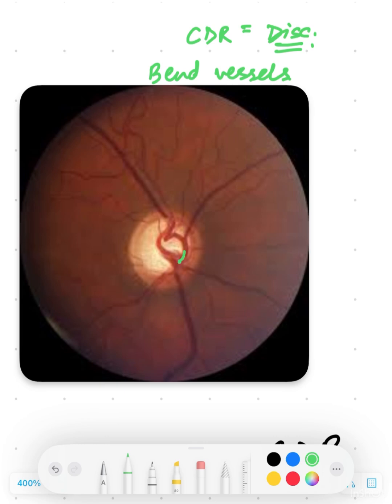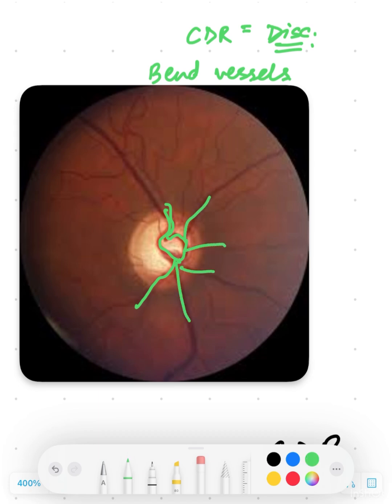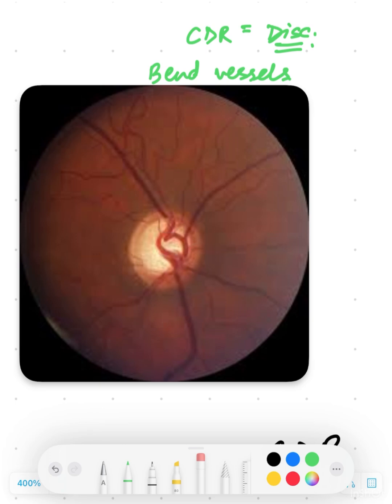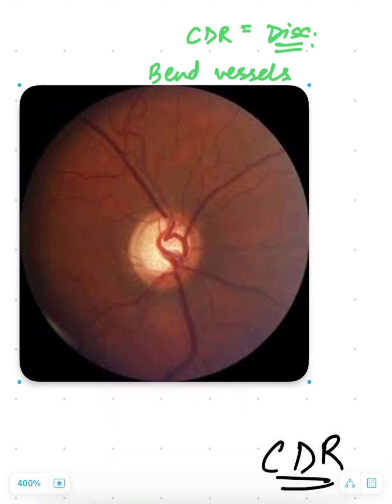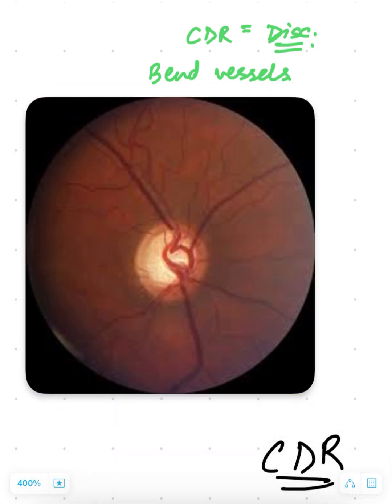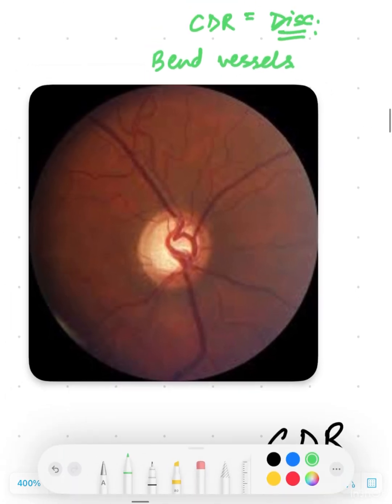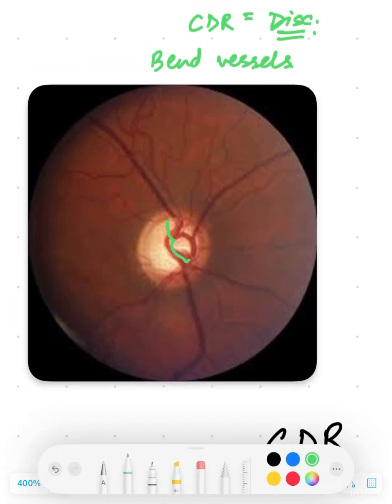There are vessels originating from the center of the disc and going out. We'll assess each one of these vessels and see where they are bending. The most prominent bend we see is in this vessel here. There is also a bend in this one above — it starts here, bends, then goes out. The vessel beside it bends here, and the next vessel is pretty much straight.